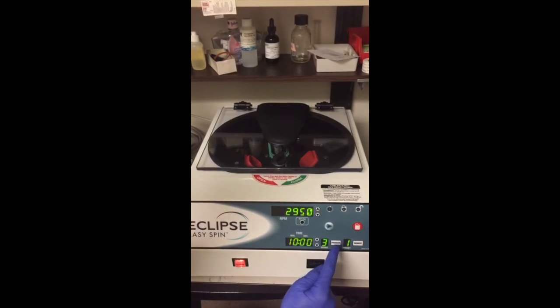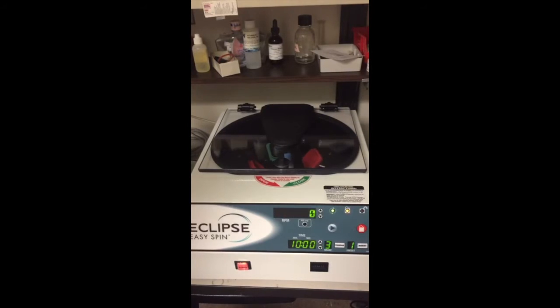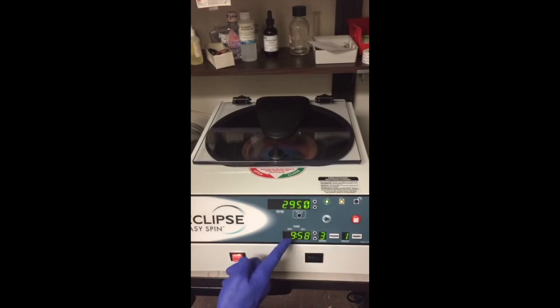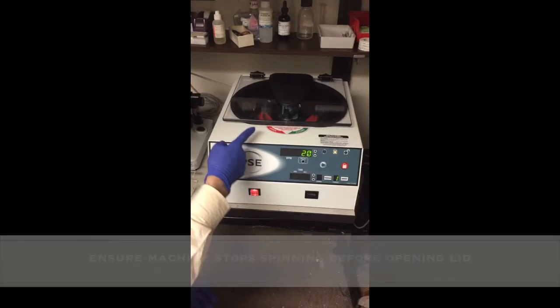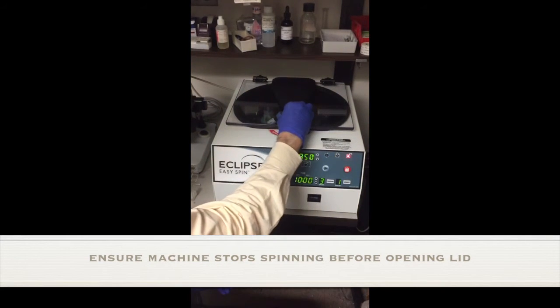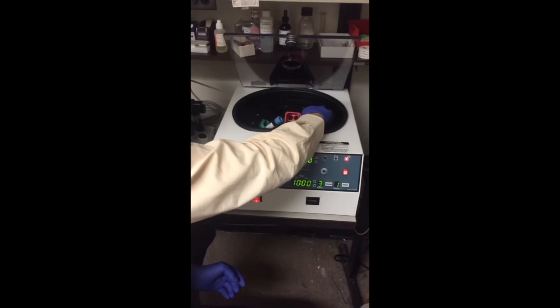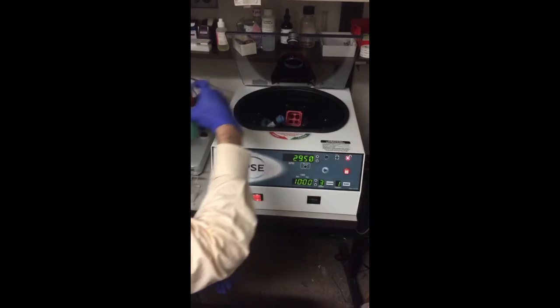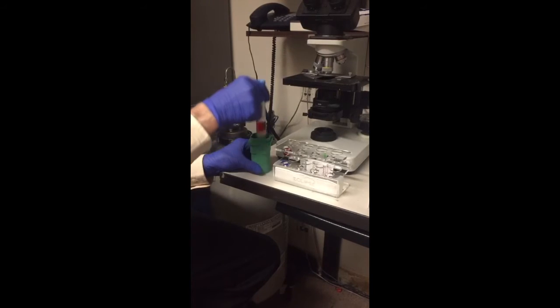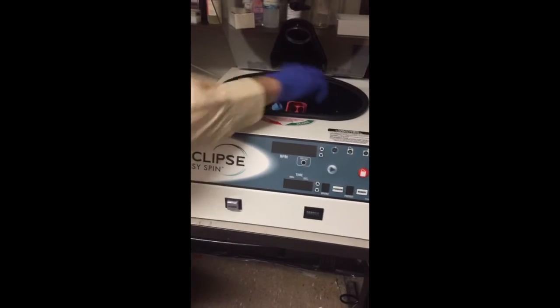All you do is press start. Now the timer starts. Once it beeps and stops, you unlock the machine and open it. Take the rotor out carefully so you can rest it without disturbing it, then place the tube in a test tube holder.